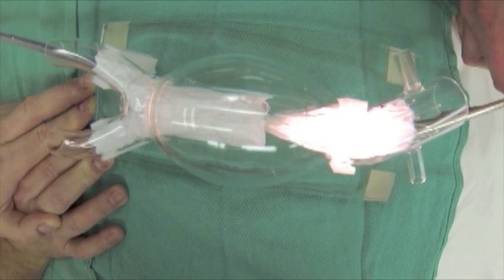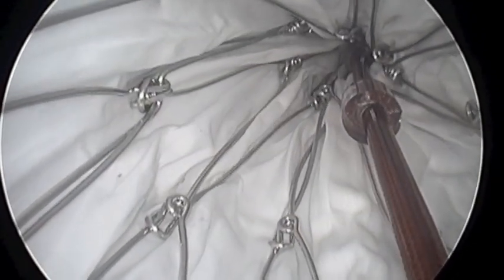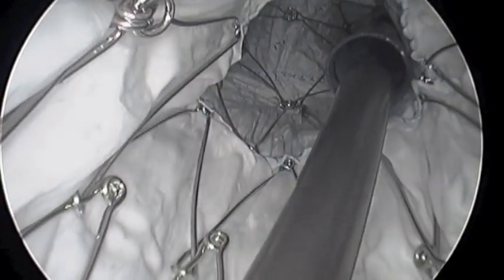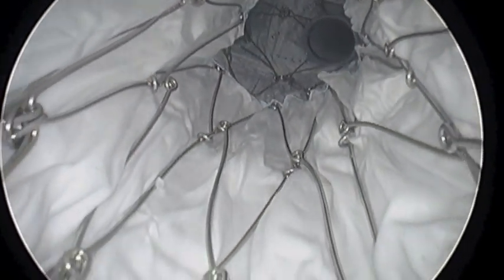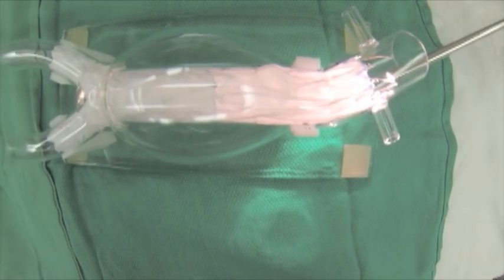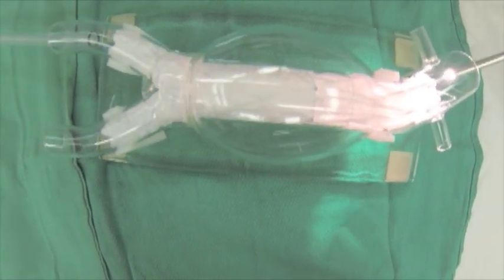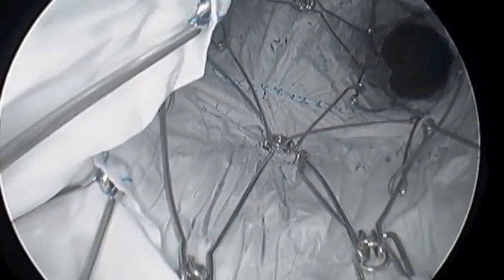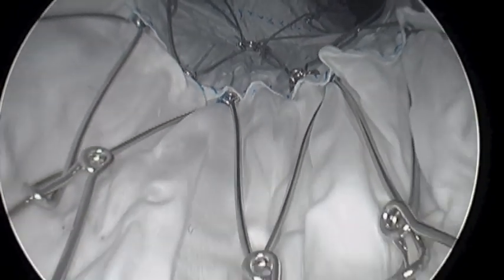You want to position it so that the covered portion is below the renal arteries. The rest of the stent is then deployed. You want to make sure there's good overlap between the two stents. Here's the finished product where the aneurysm sac is excluded, and here's an internal view of the same.